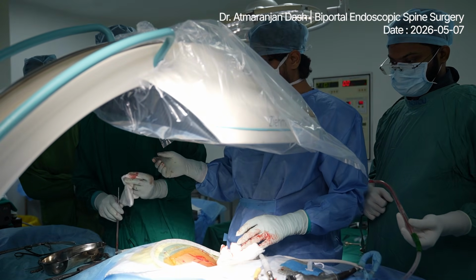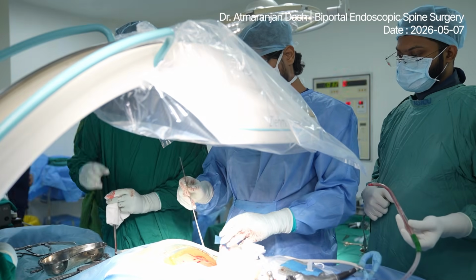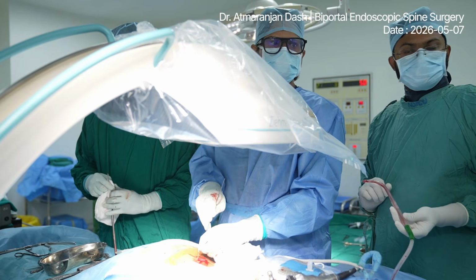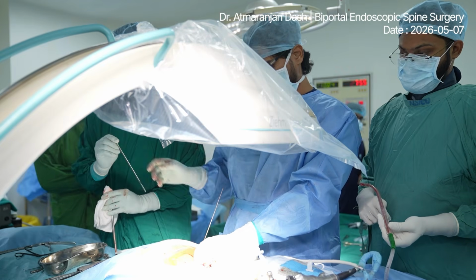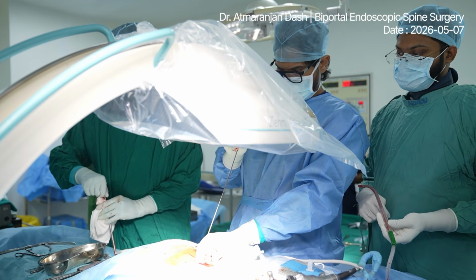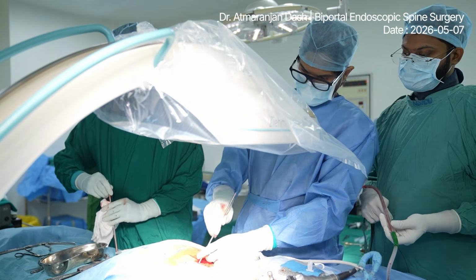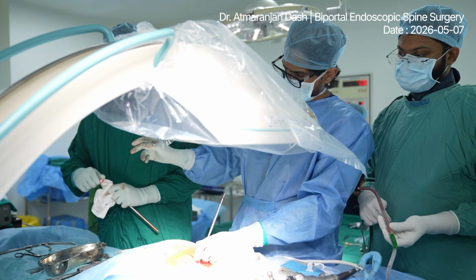Now for the inferior part, again on the TP. In these cases you may have to drill the TP a little.